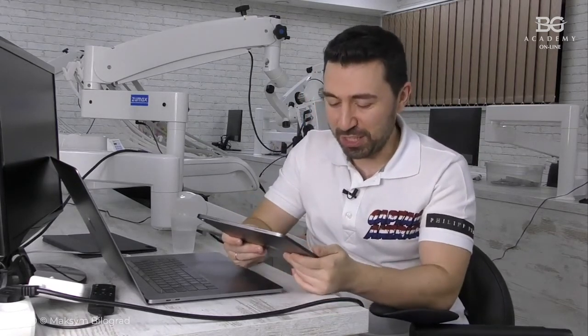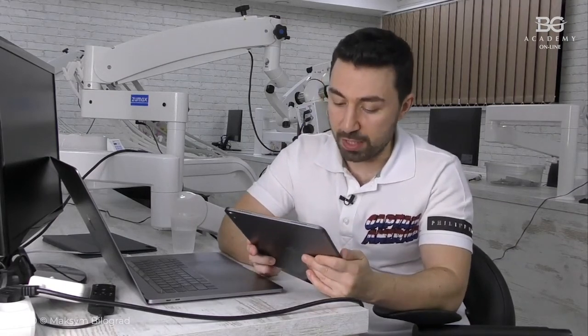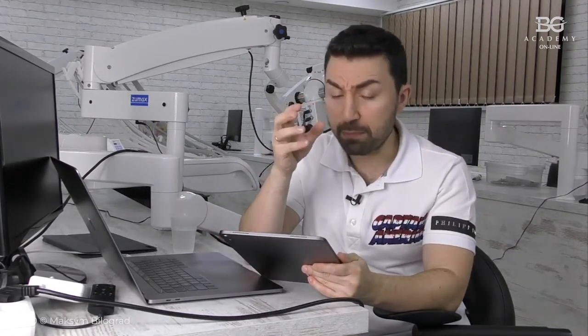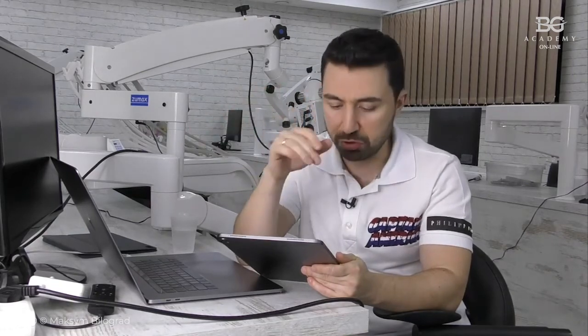The question is, if we cement 8 veneers in one session, how do you prefer to start, from which tooth? If I cement multiple veneers, in most cases I prefer to start from the central incisors. If I can fit them together, I do just the 2 centrals, then the 2 laterals, canines, premolars. So this is the sequence.